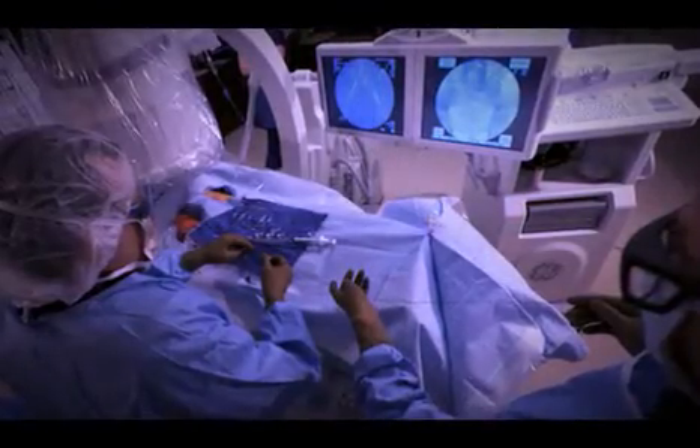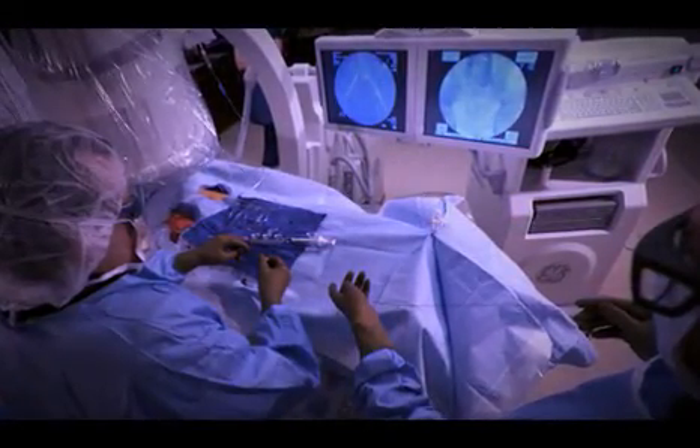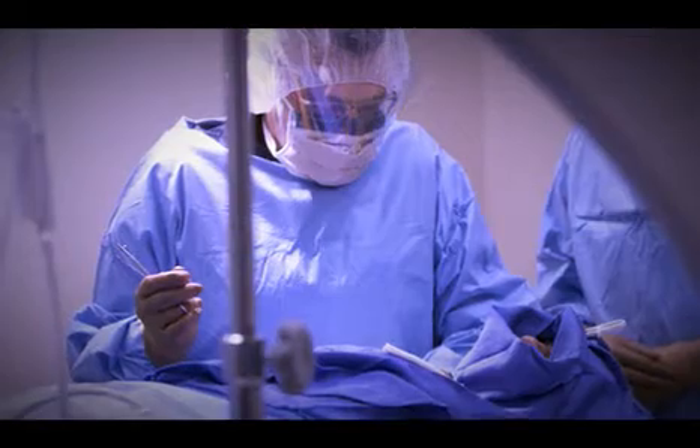Then we can open up the vein a little bit with an angioplasty balloon. For instance, if we're hoping for a fistula that's maybe six, seven, or eight millimeters, but the fistula is only three or four millimeters, we might put an angioplasty balloon in the fistula and increase its size by maybe a millimeter.